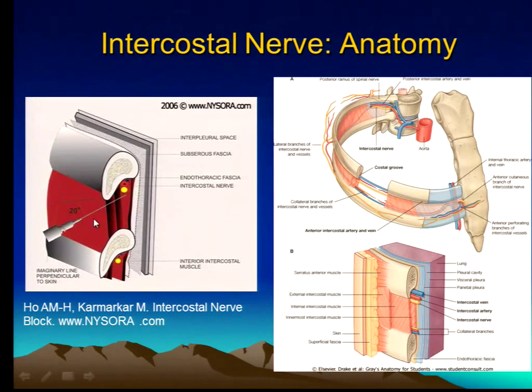Here you see the three layers: the innermost, inner, and outer intercostal muscles, and the needle is here. If you look at the orientation: vein, artery, nerve. The key factor in my practice is that if I can see the vessel, I know all I need to do is go caudal to it. Oftentimes you're not going to be able to see the nerve, but the vessel you're generally able to see.